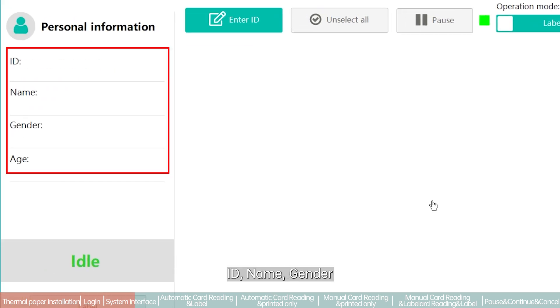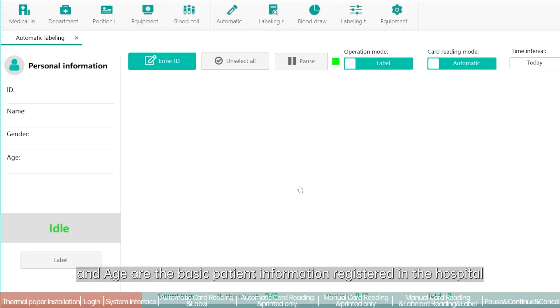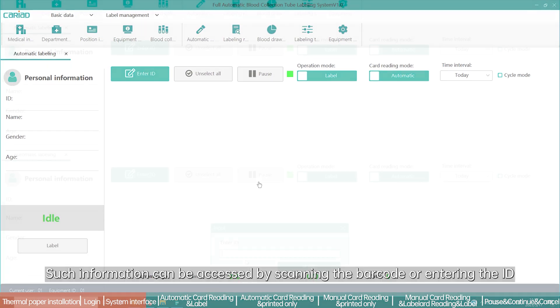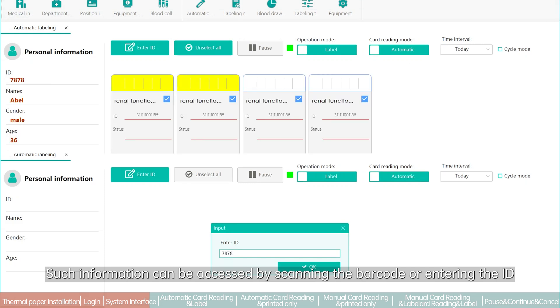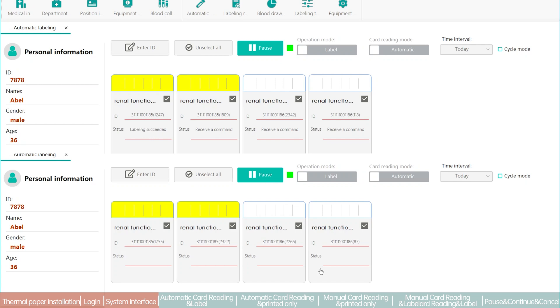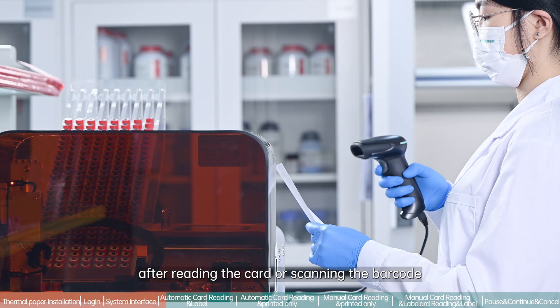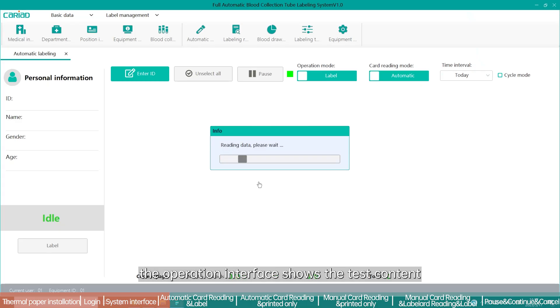After accessing the software, click automatic labeling in the labeling management interface to open the automatic labeling menu. The basic patient information — ID, name, gender, and age — is registered in the hospital system. This information can be accessed by scanning the barcode or entering the ID.